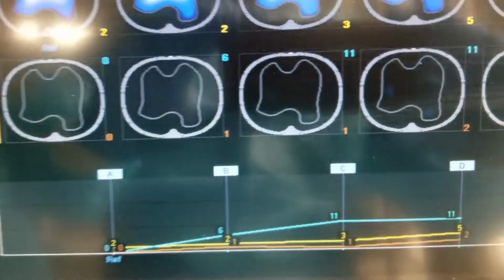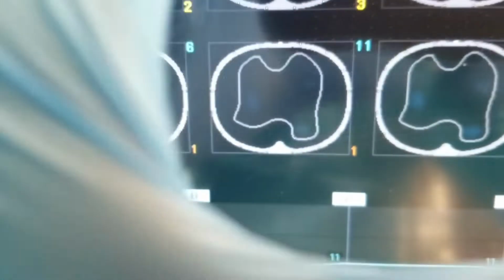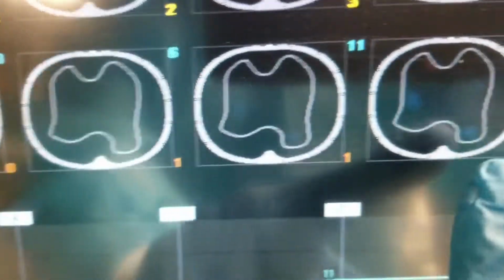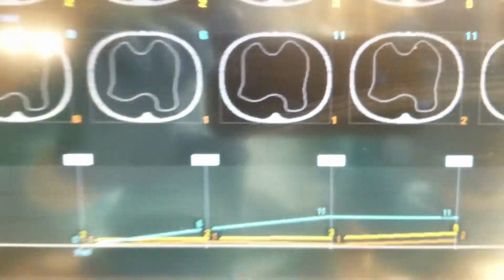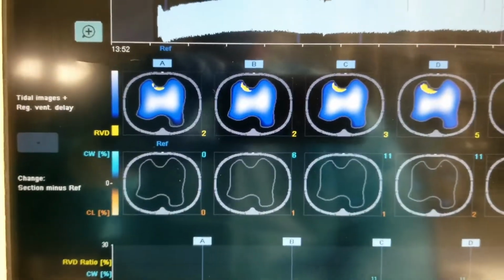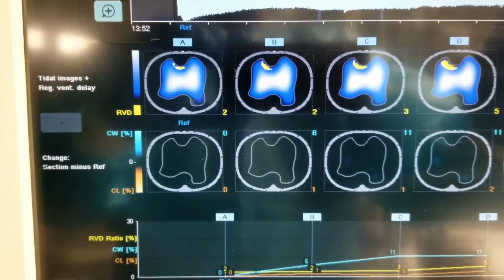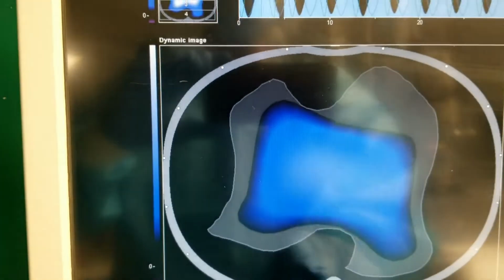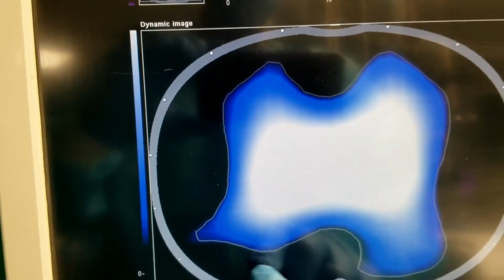It's hard to see, but you get in quite close, hopefully. We'll try and hide the light. You see? Shucks. There are 2, 3 little blue areas right there. So that would be the areas where you're increasing compliance, like on the edges, the periphery of the lung. But still not able to completely open that. It's not horrible. I mean, it's just a little patch here missing.